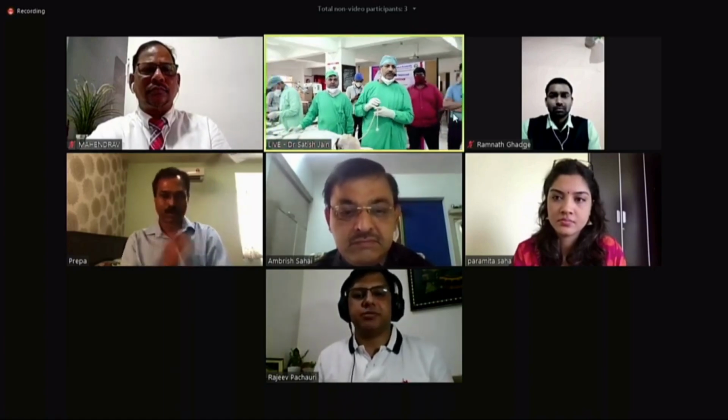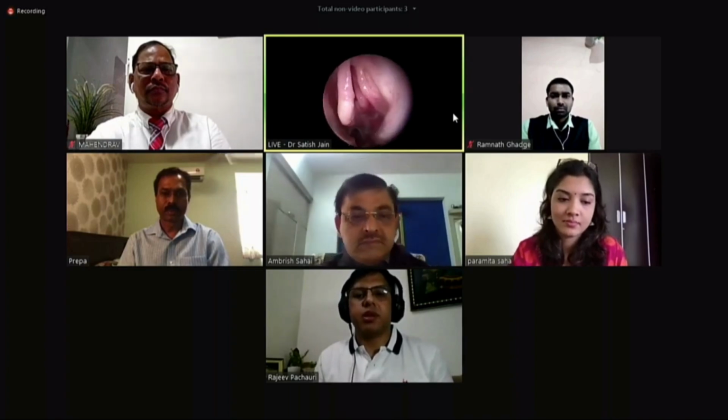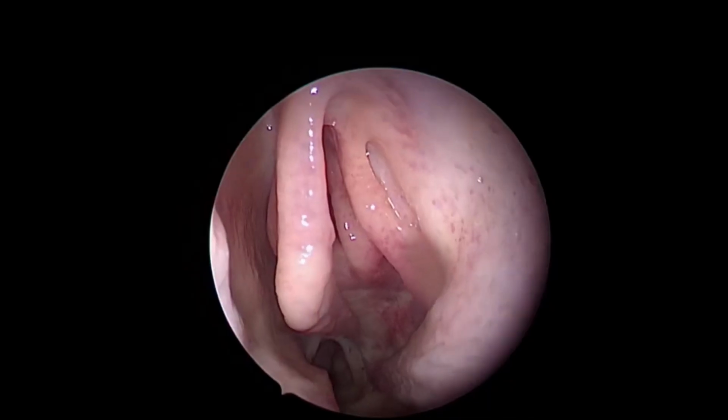And it's ultra fresh. If you get the endoscopic picture, can you give a glimpse of it? You'll be amazed to see like a live surgery going on. So this is ultra fresh, you can say. And the plans for today.